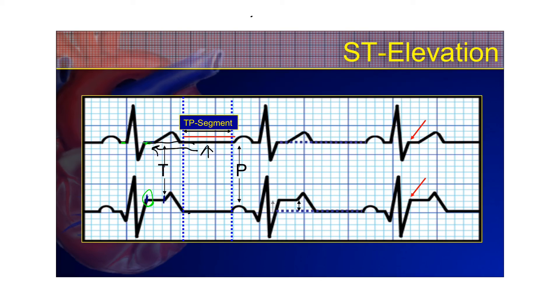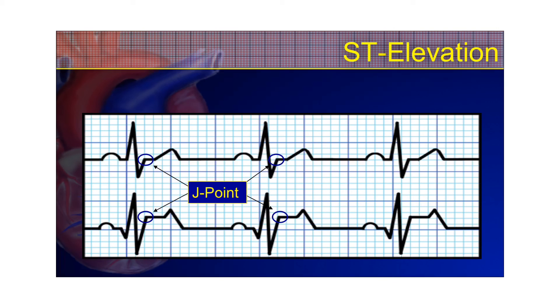On a 12-lead ECG, if the J point is diffuse and difficult to identify on one lead, look at the lead above or below it, identify it there, and draw a straight line down. The rhythm above and below any lead on a 12-lead EKG is the same exact rhythm — those QRS complexes are identical, just viewed from a different angle. This helps identify where the J point is even when one lead is unclear.